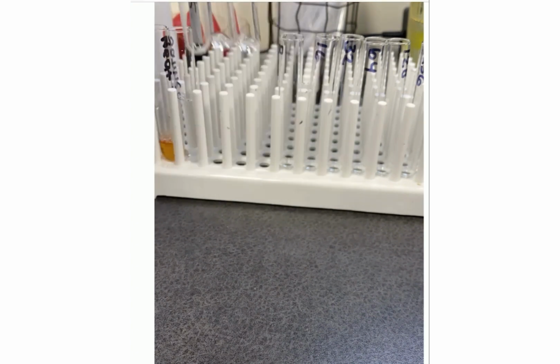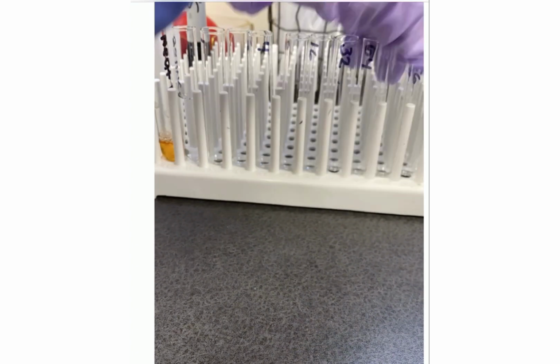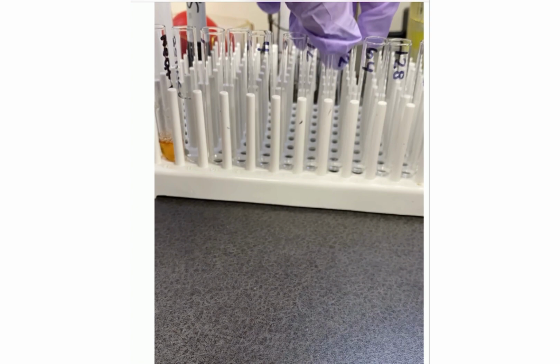I check all my tubes to make sure that I can see a clear liquid and that they correspond to what I expect in the tubes.